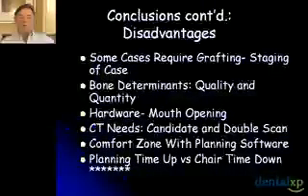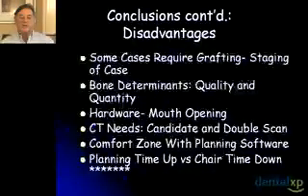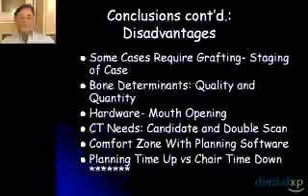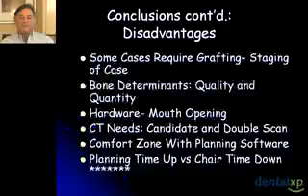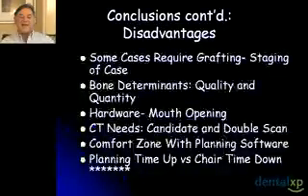Disadvantages are very, very minimal. If you have large grafting, well, that's required as a staged approach in most any of our treatment methodologies. Bone determinations, well, the 3D planning and the surgical guide cannot really control that. The patient presents with their available bone. In the diagnostic steps of the software, you can determine the various determinants of bone, whether they have quantity and quality. And if you have to do adjustments, well, that's just necessary in any case.